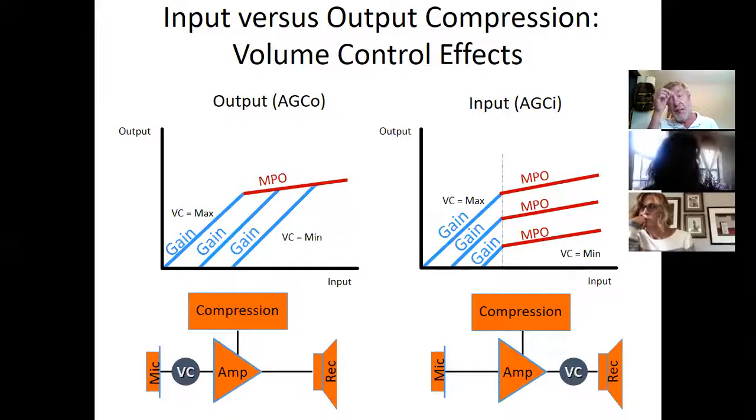So this was really useful on high power hearing aids. So the user, you would set the maximum power output because you're the clinician. You would base the MPO on the client's uncomfortable loudness level. And we said last week, how much would you add to that? Oh, around 15 or so. If the guy's UCL was 100, you might choose an MPO of 115 or 120. You'd set it. Okay, now the client can change the volume control till the cows come home, but it's not going to alter the maximum power output that the hearing aid can do.